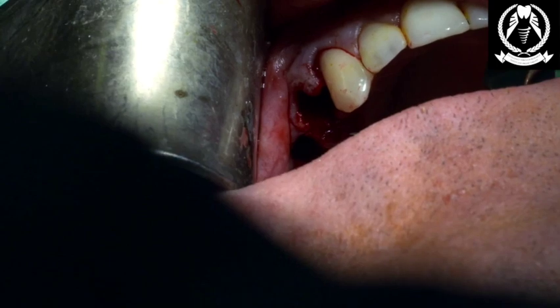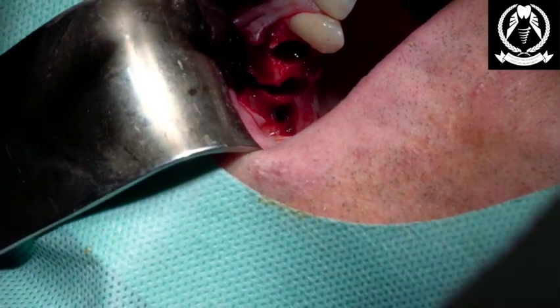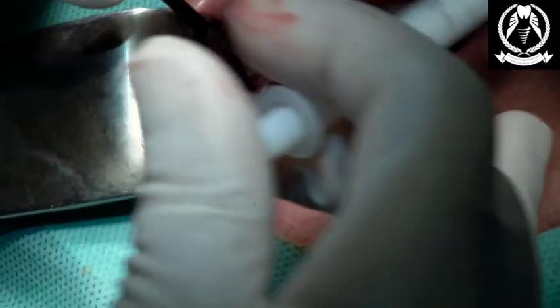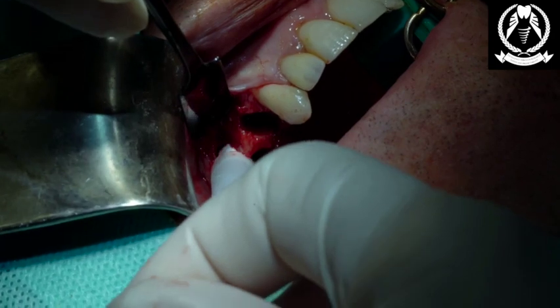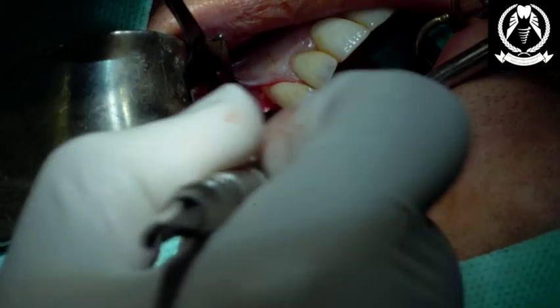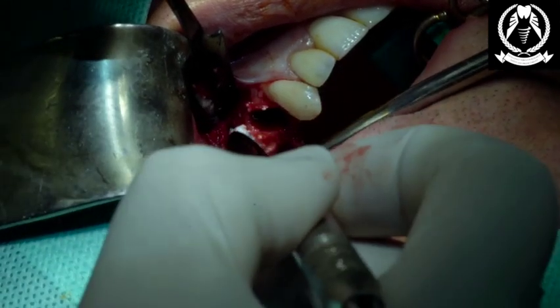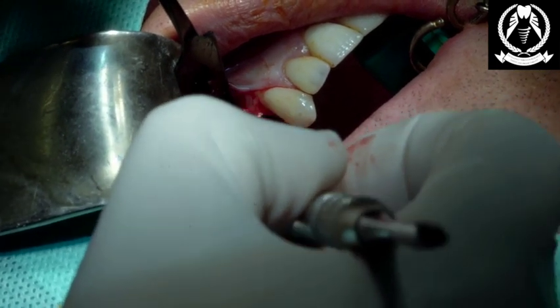Right, so what my lovely assistants are doing now is just retracting everything back, now using the Ethos. And we're just going to inject it around. Do you want to put a temporary abutment on there or healing cap prior to that? Right, so put a little bit there. You get two of the cover screws. I'm just going to put the cover screws on temporarily.